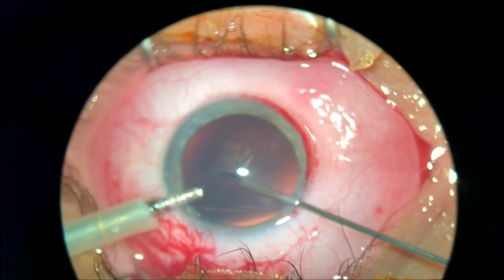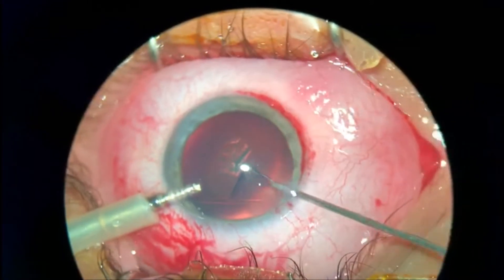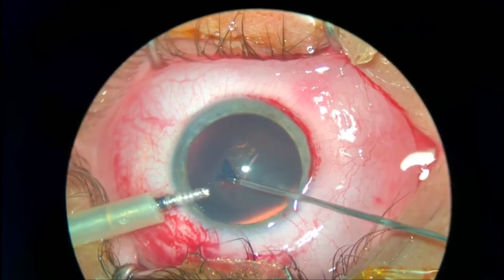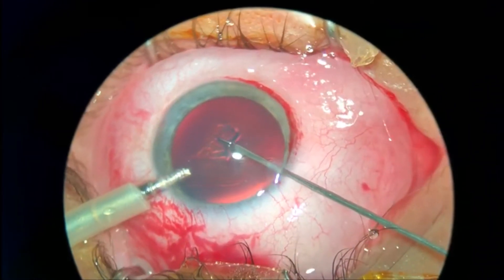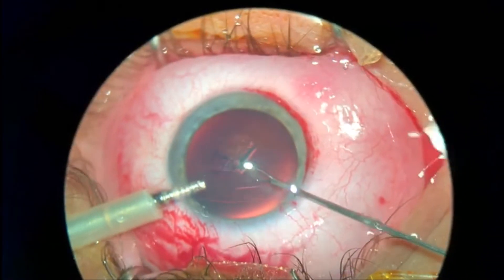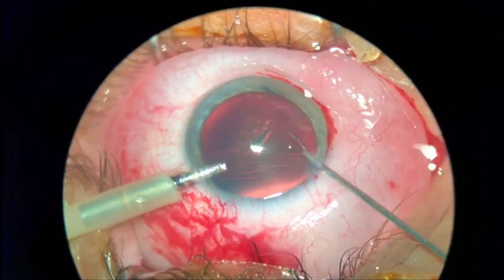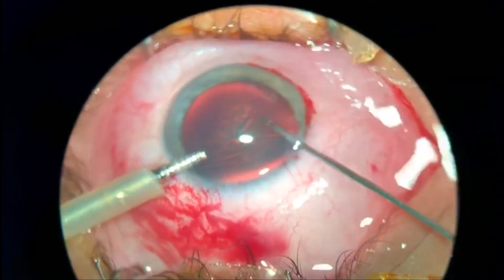The capsulorhexis is here. You need to be patient and do it very slowly, because young patients have a very elastic anterior capsule and it is very easy to run out into the periphery.